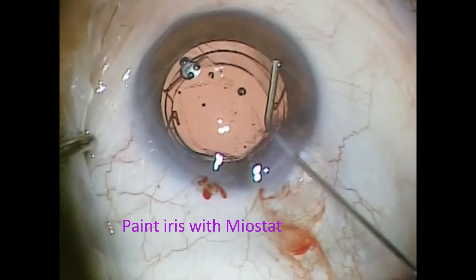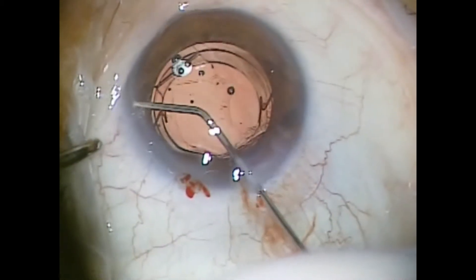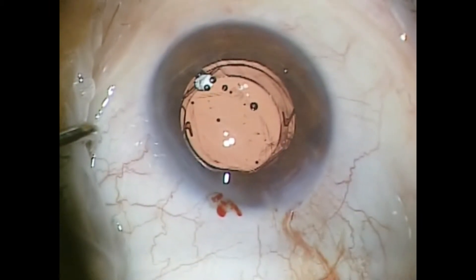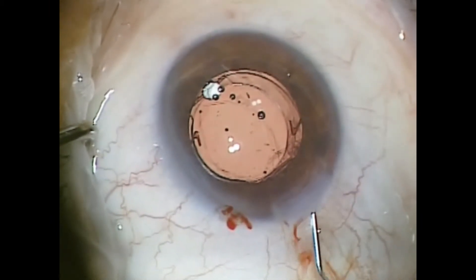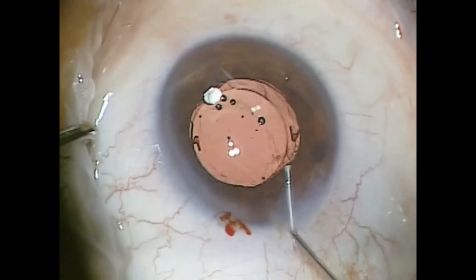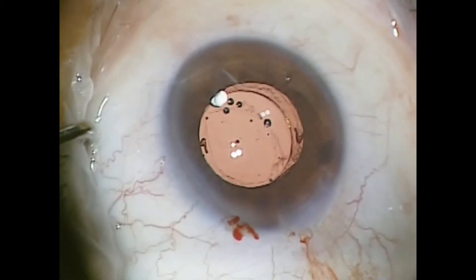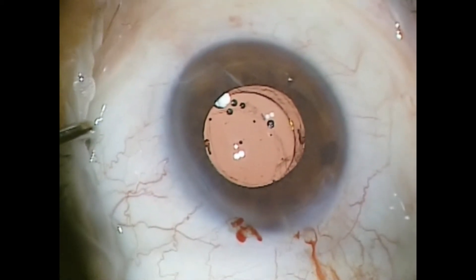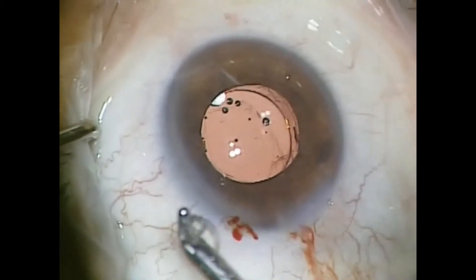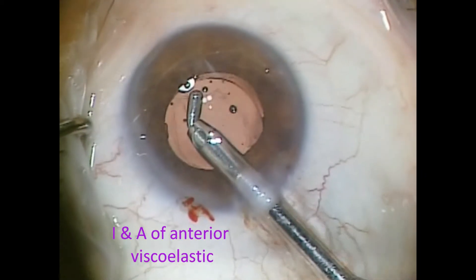Then I paint the iris with Miochol prior to removing the viscoelastic. What I want to do is bring the iris down over the larger piggyback lens. This helps tamponade the lens and the vitreous and everything behind the iris and the new lens implant. Once this has come down and we see the smaller pupil, I'll go in with I&A.